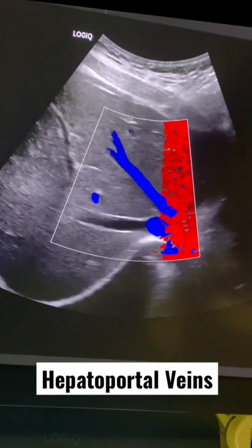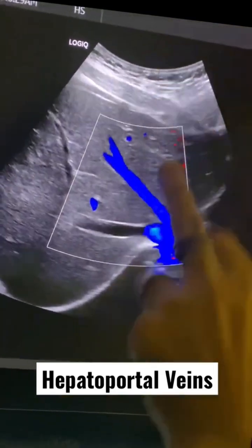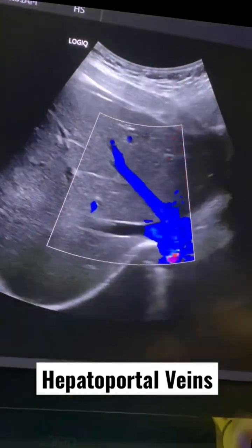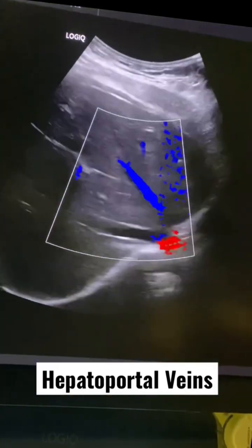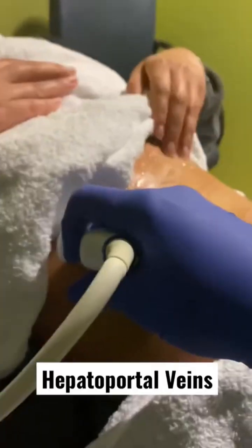Let's put some color Doppler on it. You can see the right hepatic vein is not filling with color because it's perpendicular to the ultrasound beam. So in order to get it to fill with color you have to change your approach.